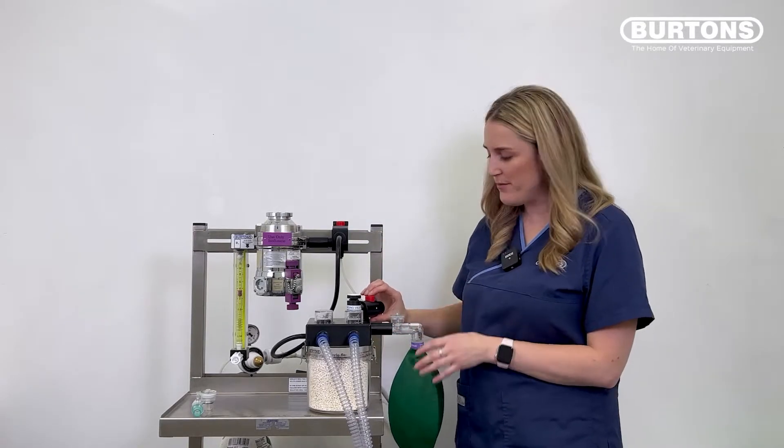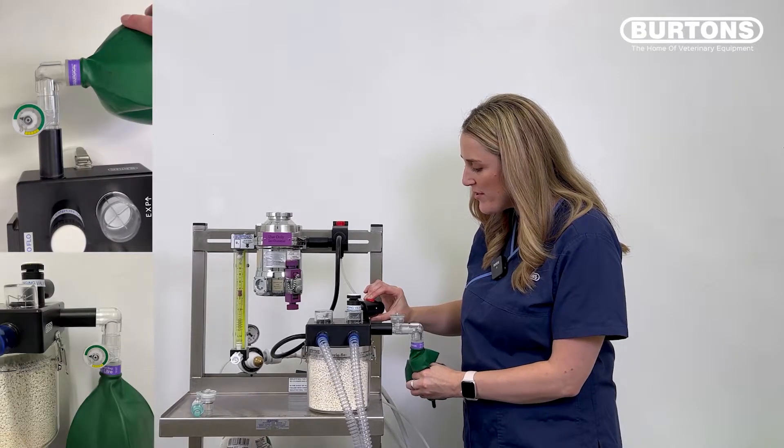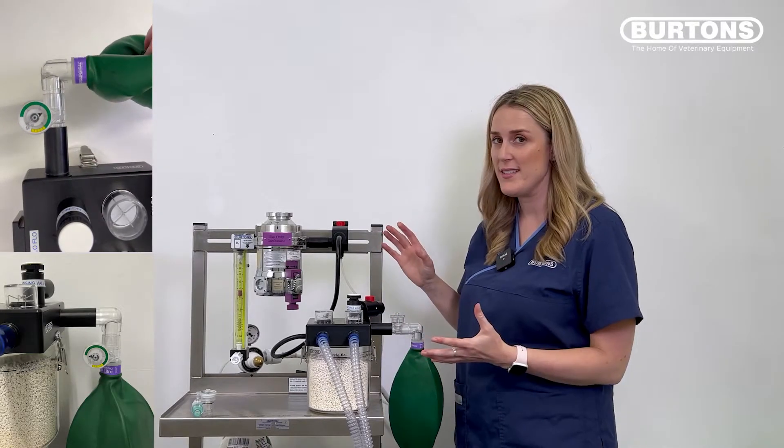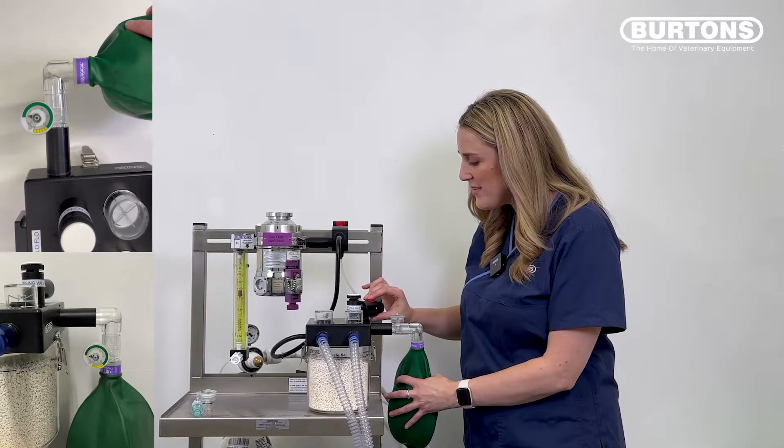And now I can give that positive pressure breath. So I'm simply going to push the button, squeeze the reservoir bag, watch the pressure rise and then release. And I can do it again. You can see how easy that is.